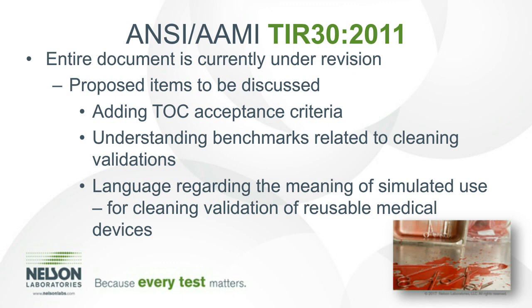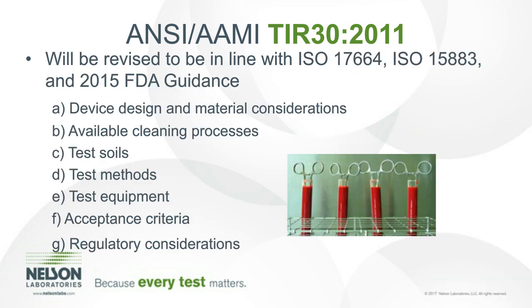TIR 30 will also be revised to be in line with the ISO documents that we have. The ISO 17664, 15883, which are for washer disinfectors, and the 2015 FDA guidance documents. And all of these topics that are outlined here are going to be harmonized somehow. We're going to make it so all the standards say the same wording.